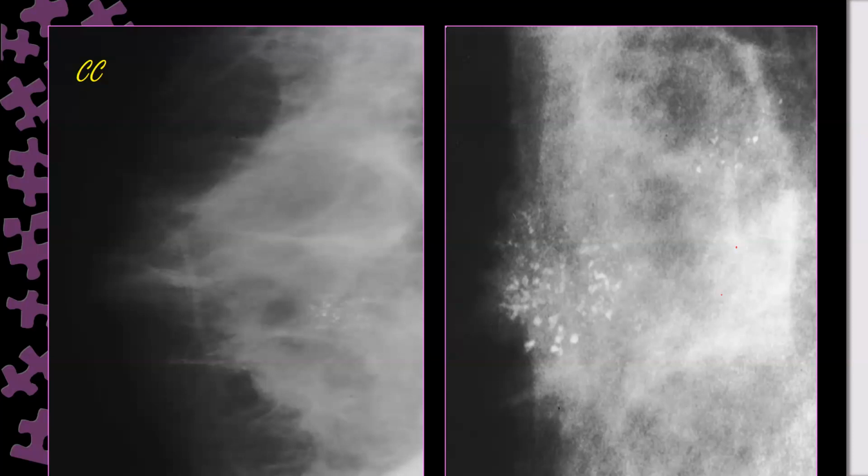Showing microcalcification of polymorphic appearance. Your voice is low. You hear me? Raise your voice, please. Showing a polymorphic microcalcification at the medial part of the right breast. What is the distribution? Regional distribution. Why did you say regional?